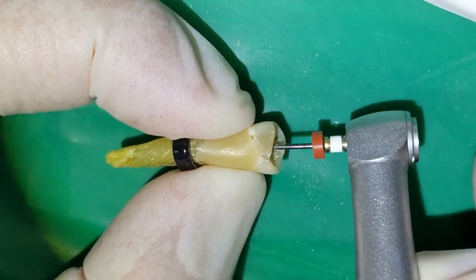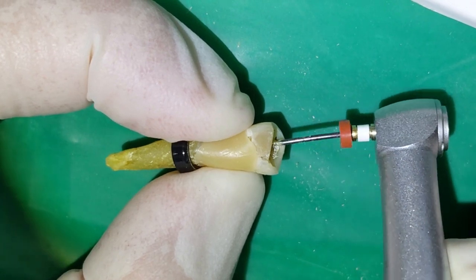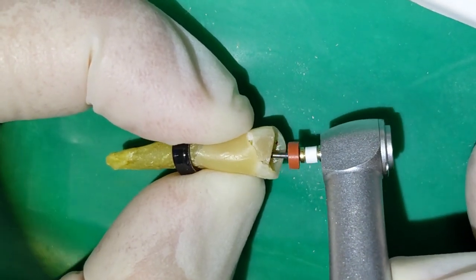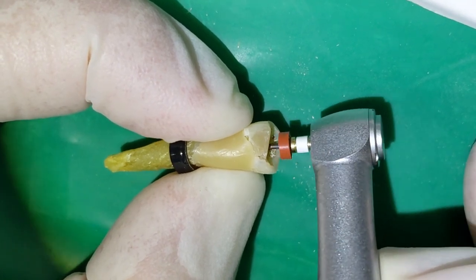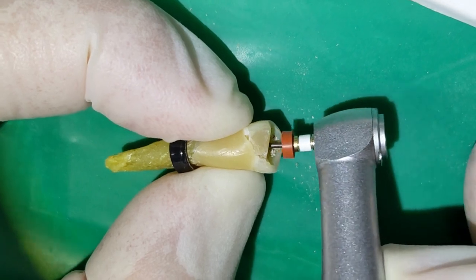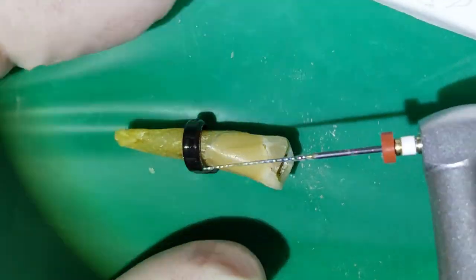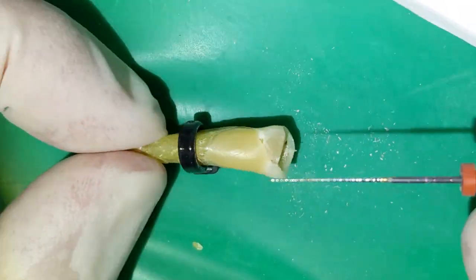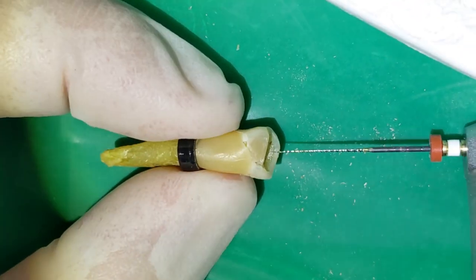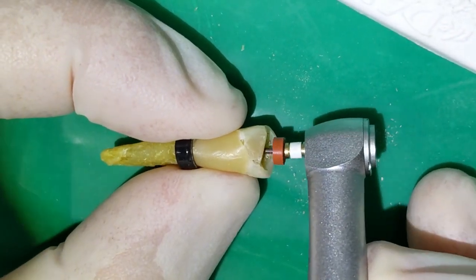The motor I'm using for this handpiece too has a torque sensor. So if it feels like the file is going to get stuck and it might possibly break, it'll sense it and it will basically turn off and start spinning backwards. So it won't let me. It helps to try to avoid breaking the files. And then also these files are pretty much single use. This is an old set I'm using that I cleaned up, but they're going to be tossed after this.